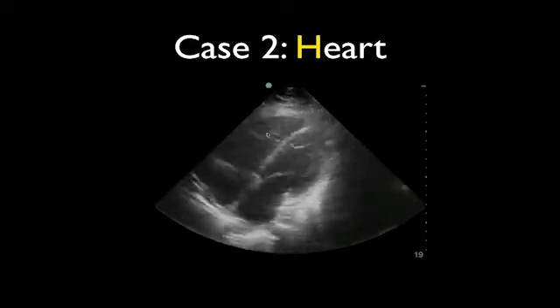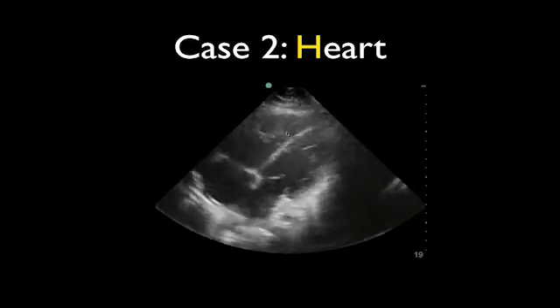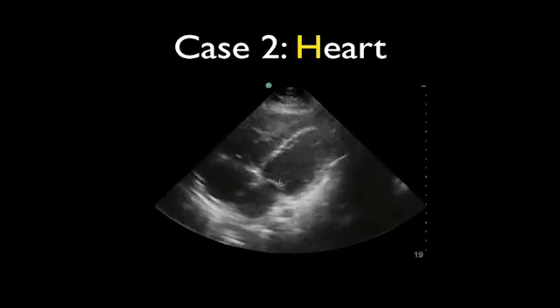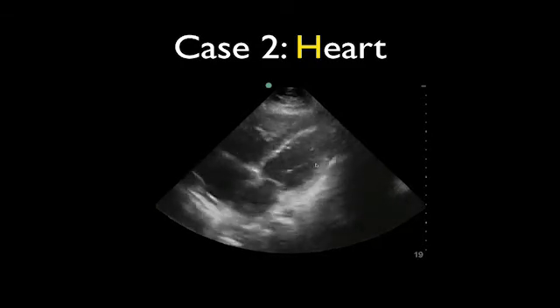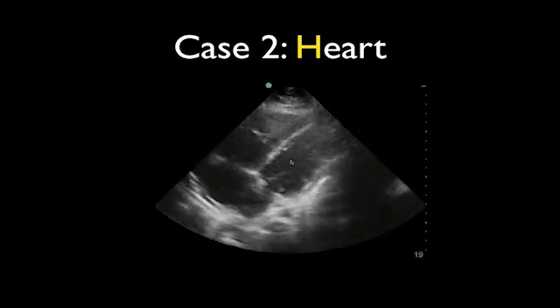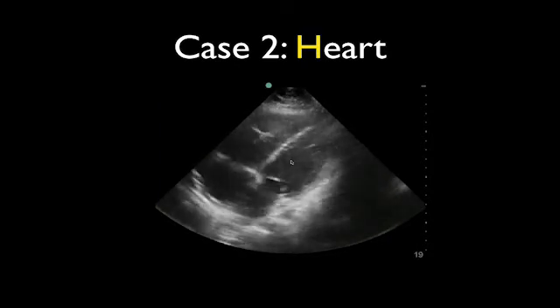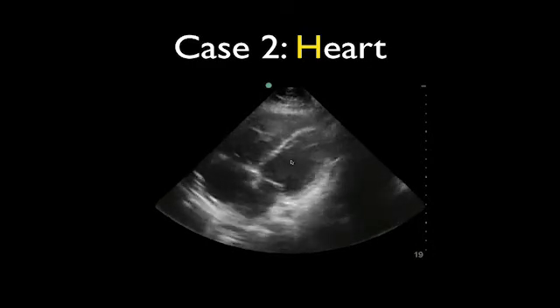So it's not the same view that we're used to for parasternal long, but which side is bigger, the left or the right? The right is much bigger. It's not supposed to be that way, right? You also see same principles that we saw in the parasternal long axis. The valve movement is much more than the wall movement. The left ventricle, the cavity doesn't change much. So we have a problem, right? This was actually one of the times that, in many situations, when you're trying to convince the ICU to take your patient, this was very helpful.